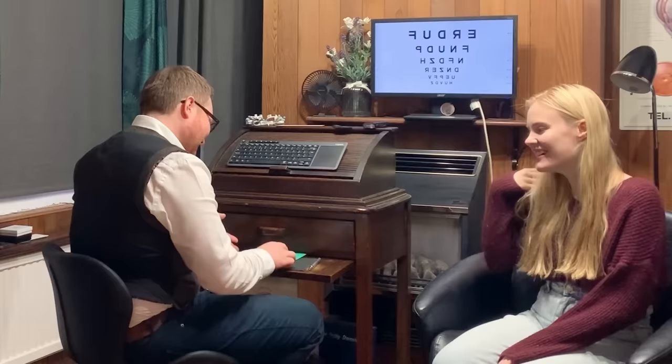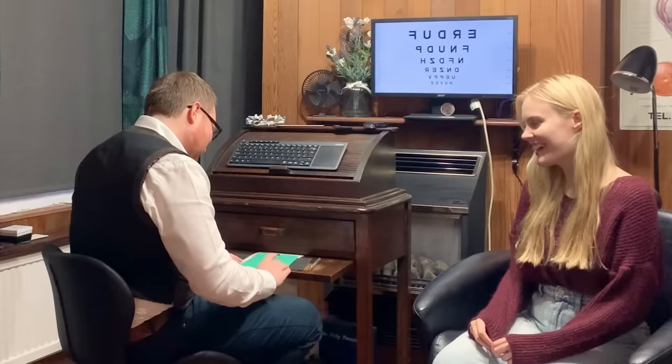That's fine. It's always good because if there's something particular that you do, it can impact the advice we give in terms of what glasses, what lenses to look for. So it's always good to get a feel for what you get up to on a daily basis. Excellent. Right. Now, you mentioned some glasses. Have you got those with you today? Yes, I have. Do you want to have a quick look at those? Yeah, of course.